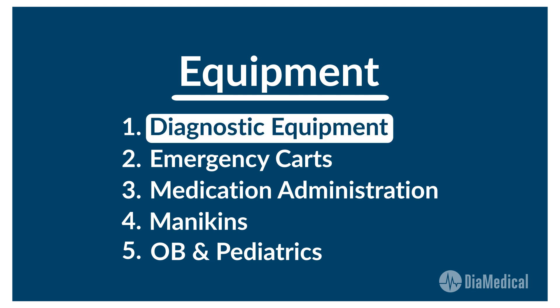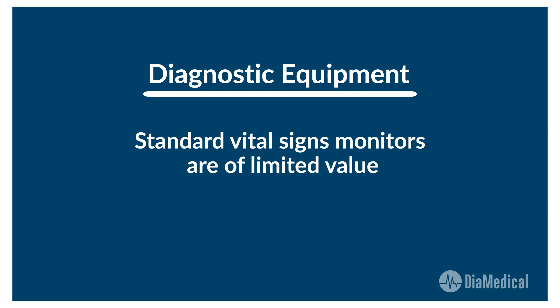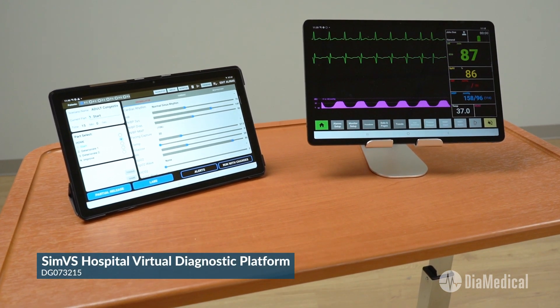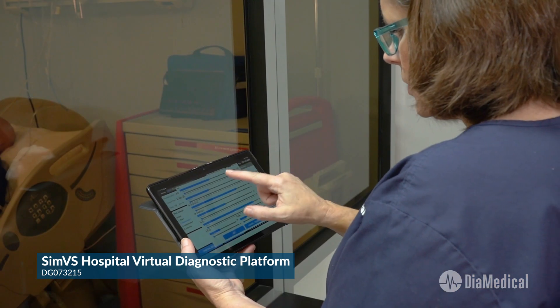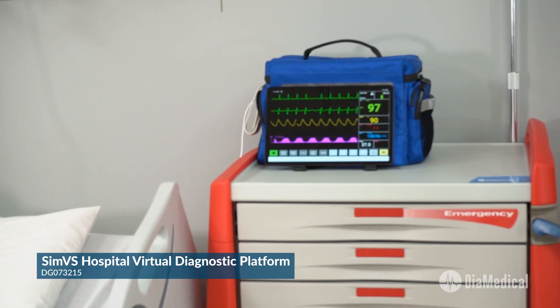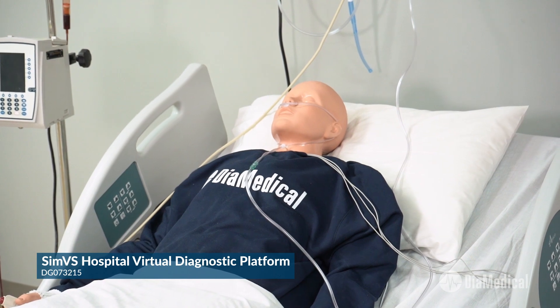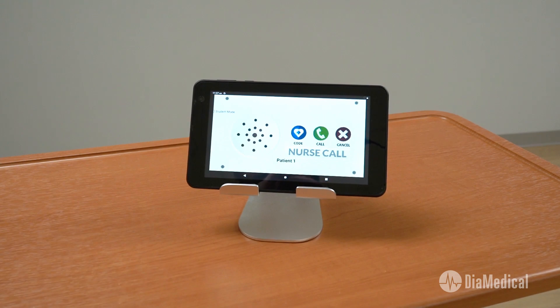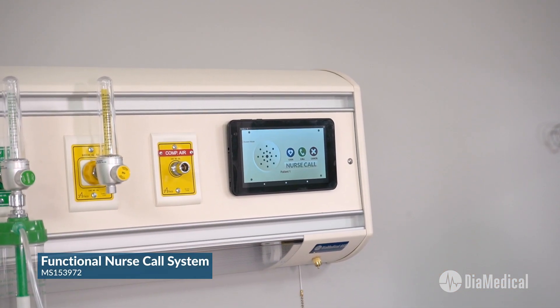Let's start with diagnostic equipment. Standard vital signs monitors are of limited value in sim labs because they cannot reflect abnormal patient conditions in real time. The SIMVS Hospital virtual diagnostic platform allows instructors to display vital signs conditions that correlate with various patient conditions and change them in real time in response to student intervention. SIMVS Hospital can be used for all types of skills demonstrations as well as interactive simulation scenarios. SIMVS also offers a functional nurse call system that can be installed on any new or pre-existing head wall.